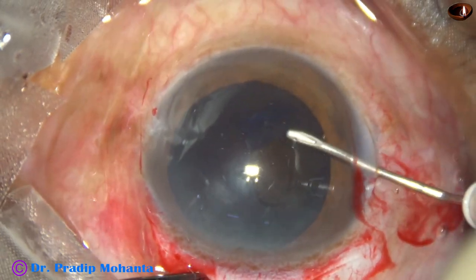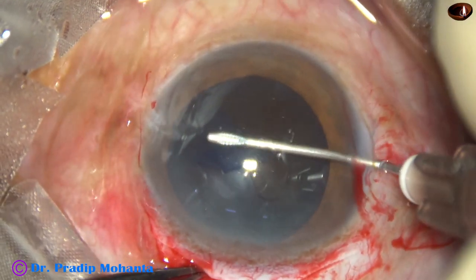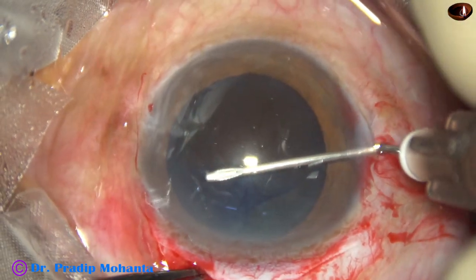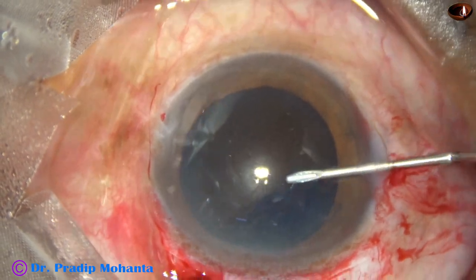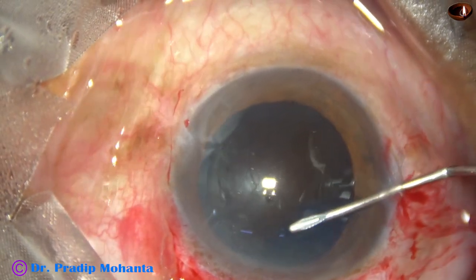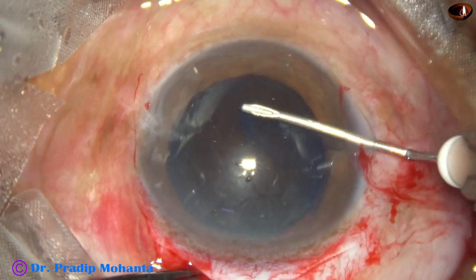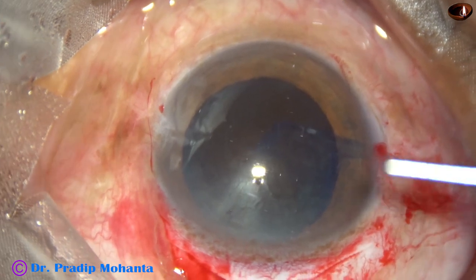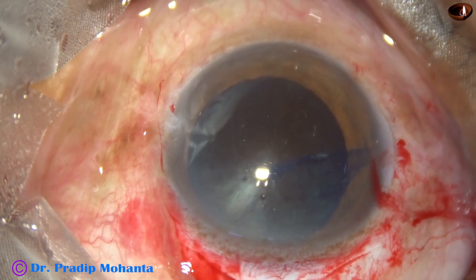Now, let us come to this video again. See, there is some contrast which the trypan blue dye has given, and I'm going to do a very large capsulotomy. It is very important, otherwise this huge nucleus will not come out of the capsular bag. So I'm doing a very large capsulotomy, maybe about 6 millimeter or 6.25 millimeter. Capsulotomy is done, and now I inject a bit of visco, increase the intraocular pressure, and then open the sclerocorneal tunnel.